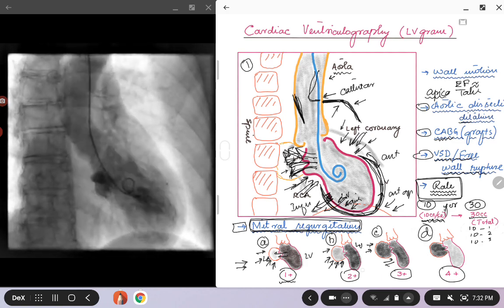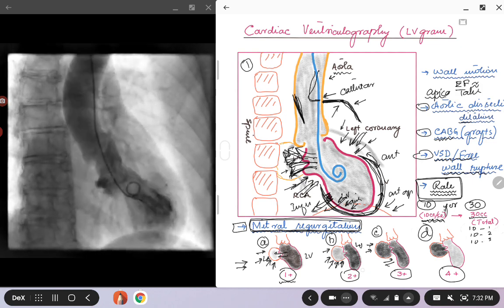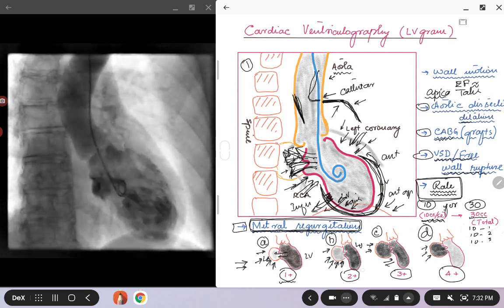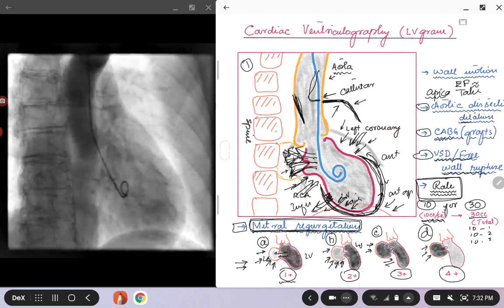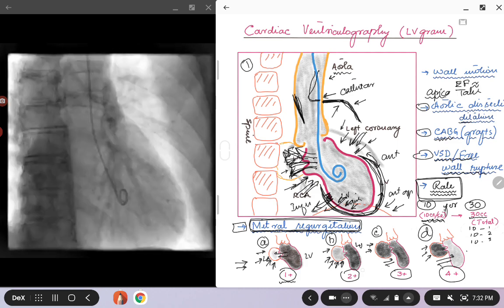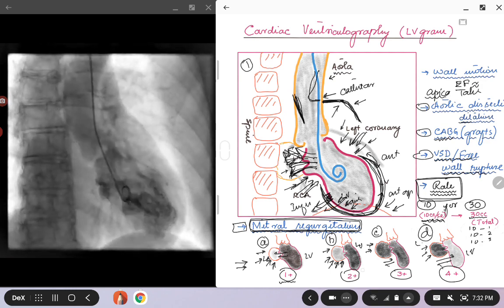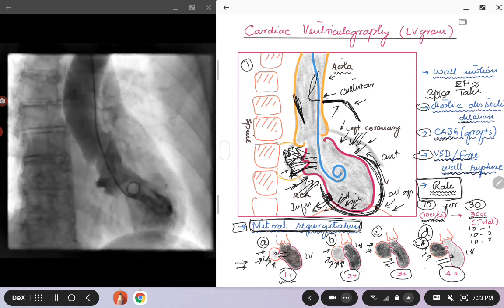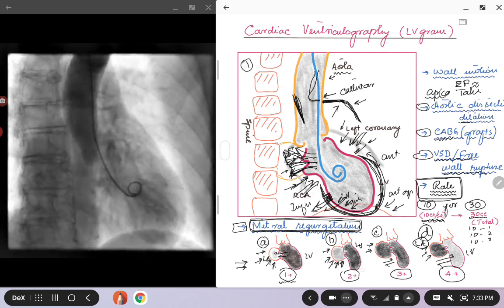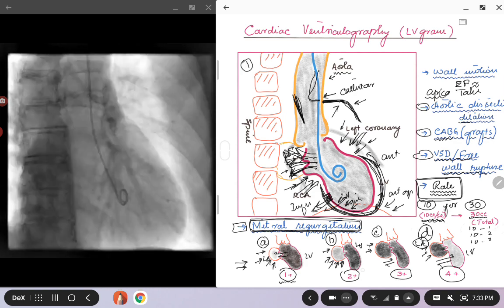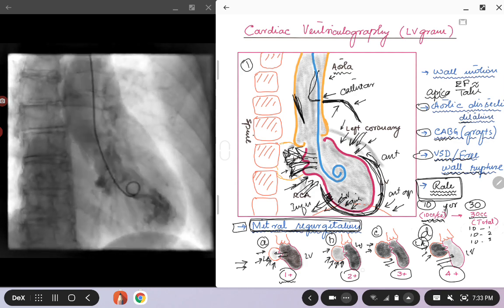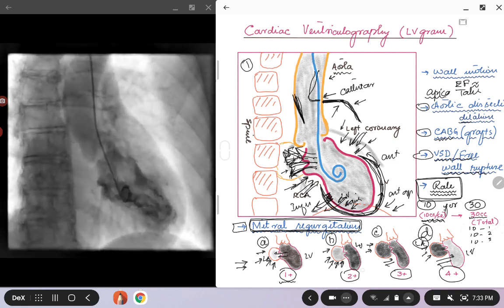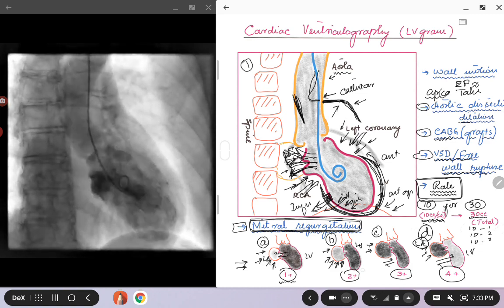Last but not least is 4+ MR. All the things we already talked about apply — the left atrium will be dilated, there will be a lot of dye going into the left atrium — but the key distinction is there will come a time when there is less dye in the left ventricle and more dye just swirling in the left atrium. To put it in perspective: for 4+ MR, the dye keeps hanging in the left atrium and eventually all the dye from the left ventricle has cleared, making the left ventricle appear lighter while the left atrium appears darker.